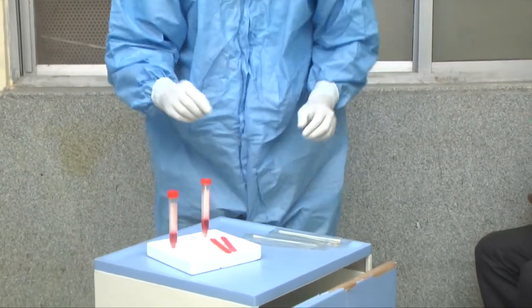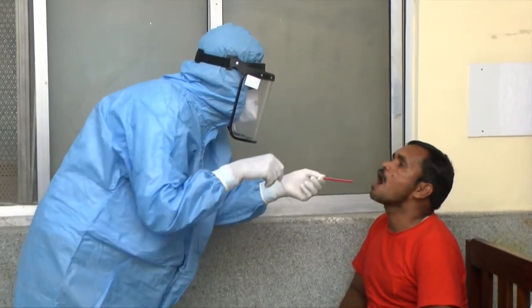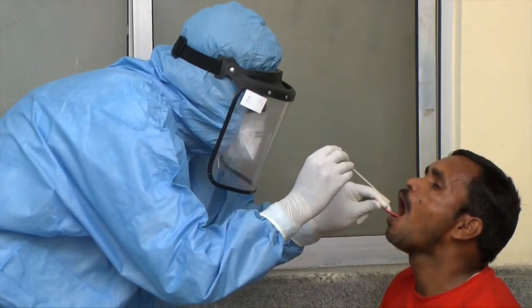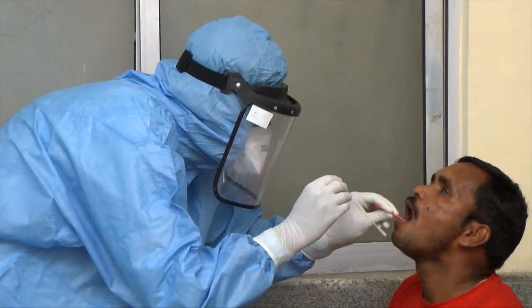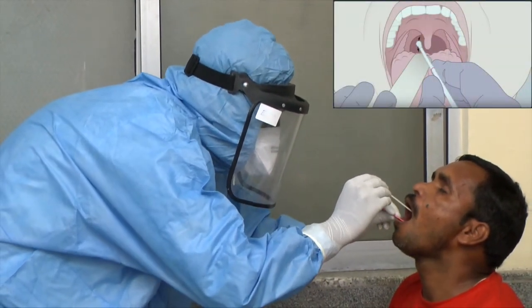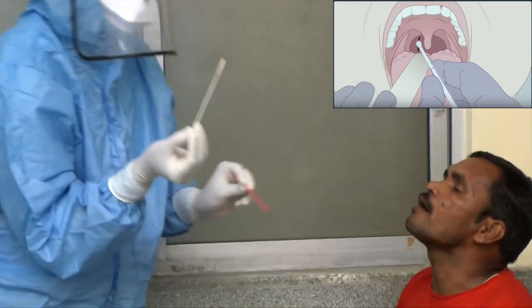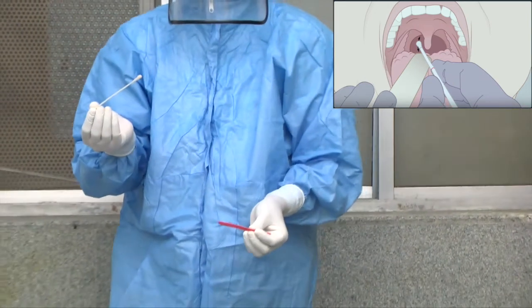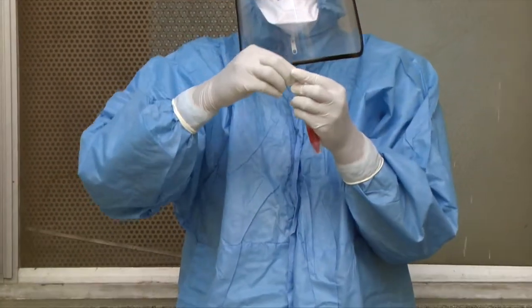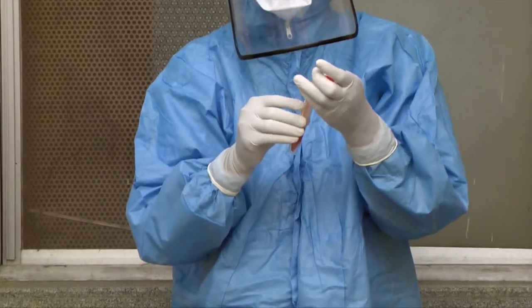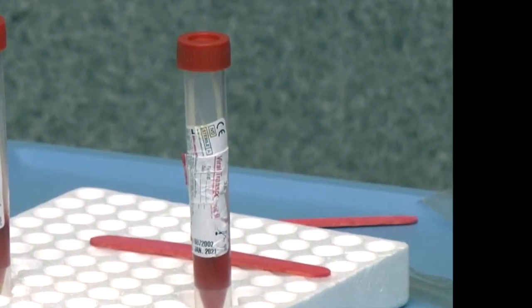Next I will be demonstrating how to collect an oropharyngeal swab. Tilt the patient's head slightly so that the floor of the mouth is horizontal to your eyesight. Using the tongue depressor, insert the swab stick without touching the tongue. Touch the posterior wall of the pharynx without touching the uvula. Once the swab is collected, cut the swab stick and keep it in the same viral transport medium.